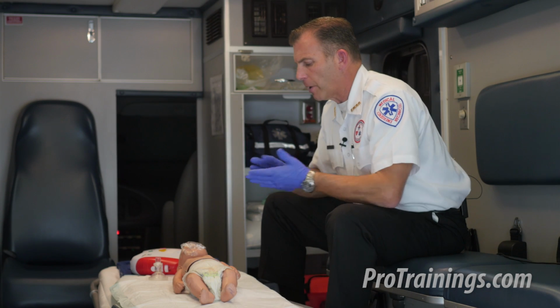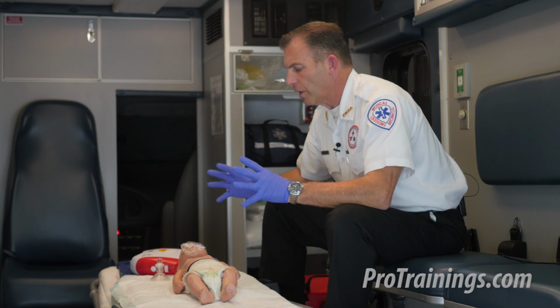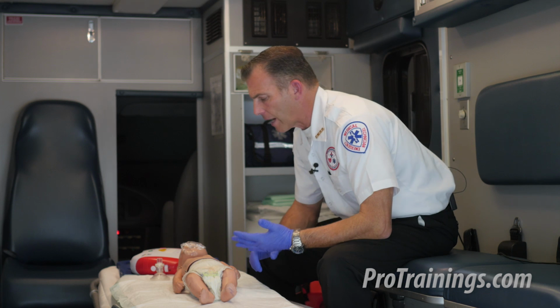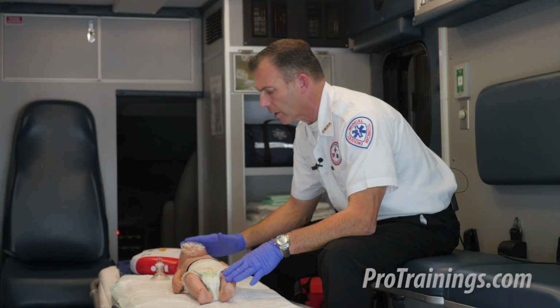The scene is safe, my gloves are on, my rescue mask with a one-way valve is available. The scene is also safe enough to use an automated external defibrillator because I've checked for flammable gases, liquids, or a pool of water that the victim might be lying in, which is not the case.